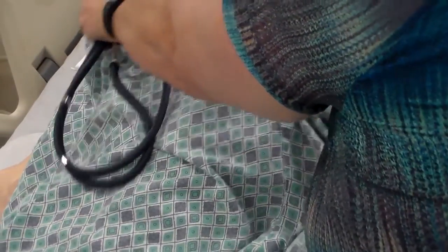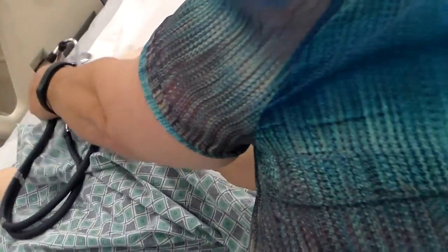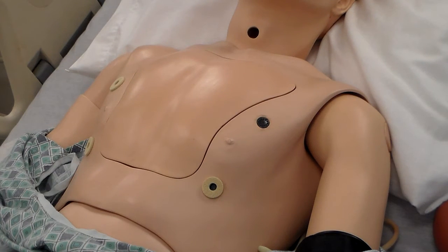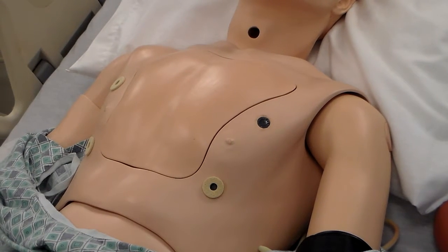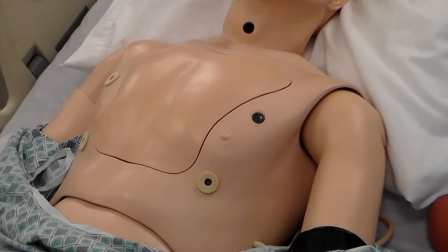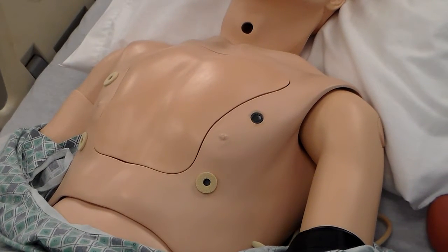So what you're going to do is you're going to expose the chest. This gown doesn't unsnap on the sides. So you're just going to make sure that you can visualize the whole chest. What are you looking for right at this moment? Okay, you're inspecting. So you're inspecting for bumps, lumps, bruises, scratches, anything that is unusual for a normal looking chest, okay? All right? Then you're going to auscultate breath sounds in a symmetrical pattern.